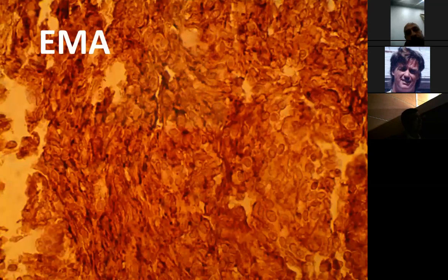For meningeal tumors, we're starting here with immunohistochemical stains. We use them to characterize the tumor and for prognostic features. EMA is the epithelial membrane antigen, a specific marker that highlights meningeal cells. As you can see, they take the brown color. This is specific staining for meningioma, confirming the diagnosis of meningioma.